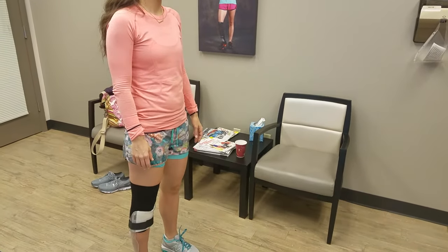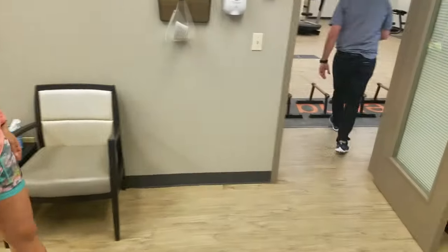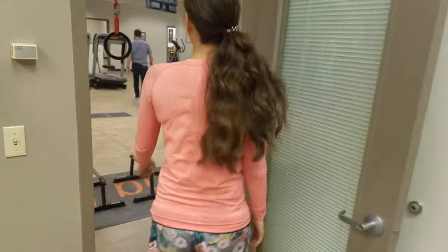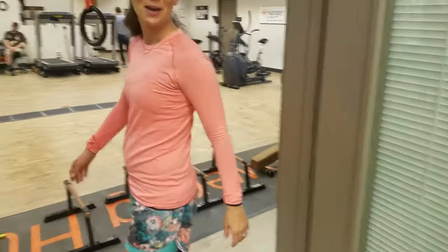You can keep walking and I'm checking with somebody. Let's go out here and walk. Ready to go shopping at the mall.